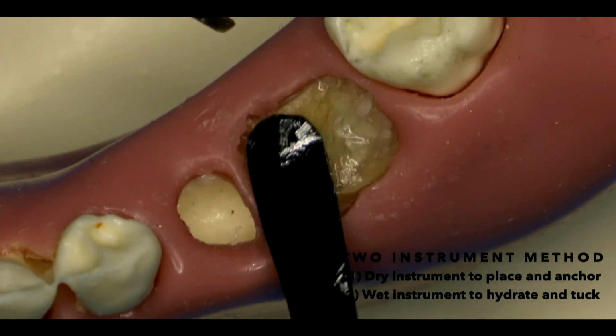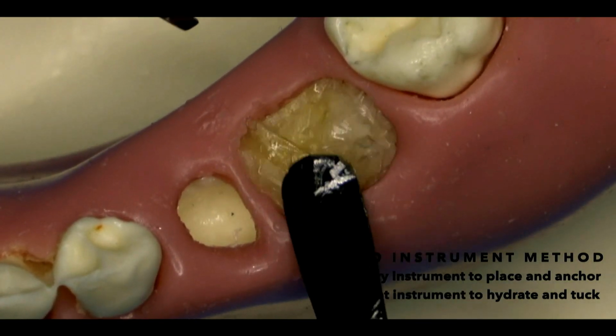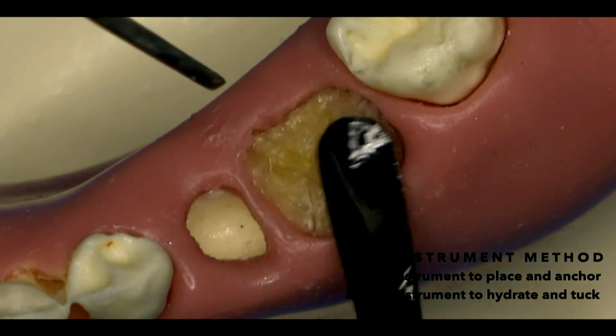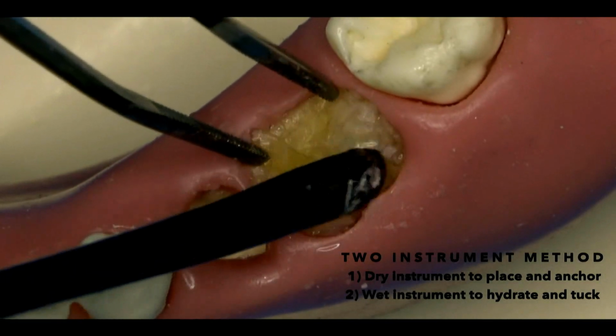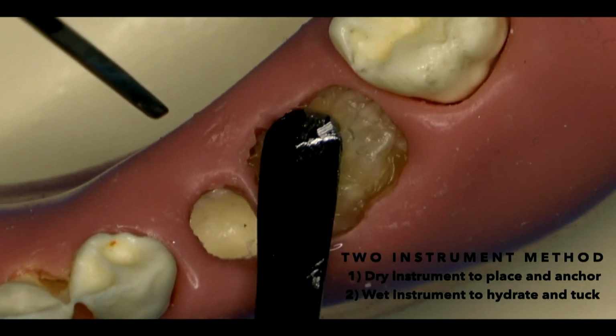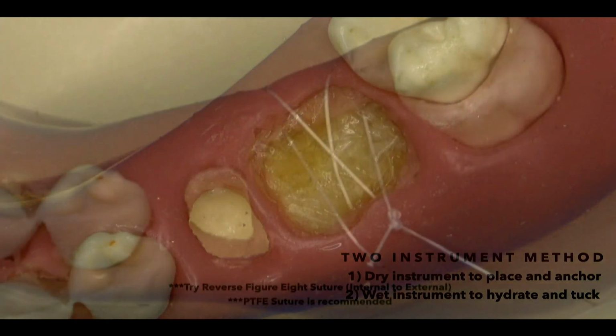Again, collagen membranes, you try to do this and it starts to fold over on itself, it's not going to work very well. But for this, it's perfect because any of these areas that have a double layer or they're starting to conform over itself is no problem. And so we don't want to be overly particular here. We don't want to mess with this too much. We just want to get it tucked in just very gently under the marginal flaps.